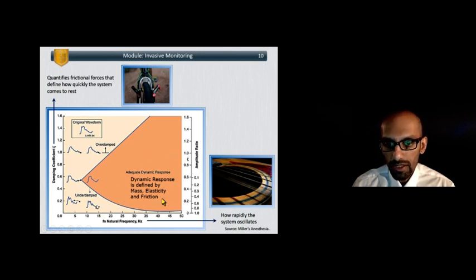And so when you have optimal damping to reduce the excess amount of oscillations, you're in the range of adequate dynamic response. Which basically says that you have optimal damping relative to the amount of oscillations in your fluid-filled catheter system, and the waveform that you're getting for your art line is an accurate measure and reflection of the true arterial pressure in the patient. So that's what that all means. Again, I go over this in the Part 1 basic exam material as well, but I wanted to review it so you have a refresher course, so to speak, on that concept.